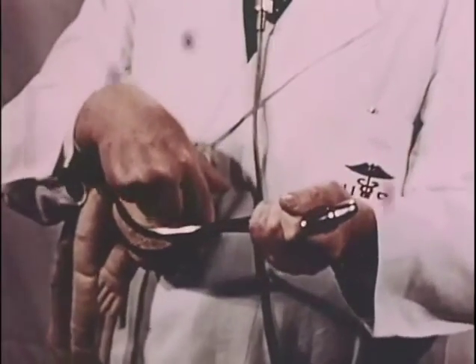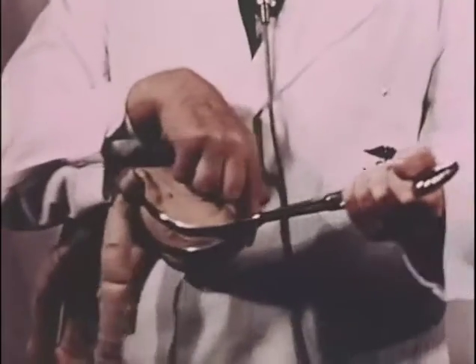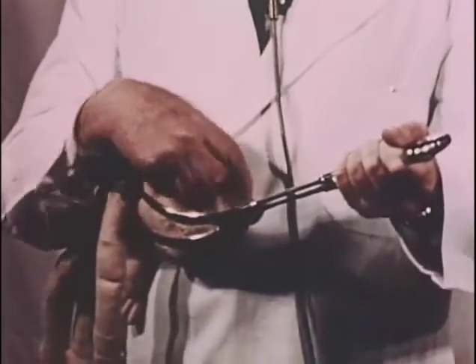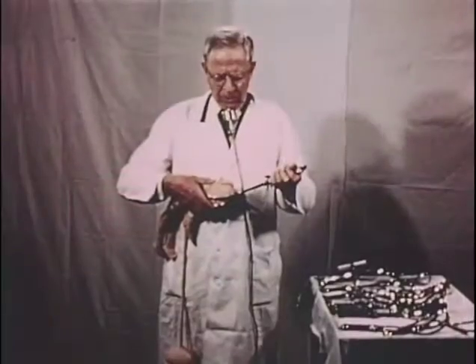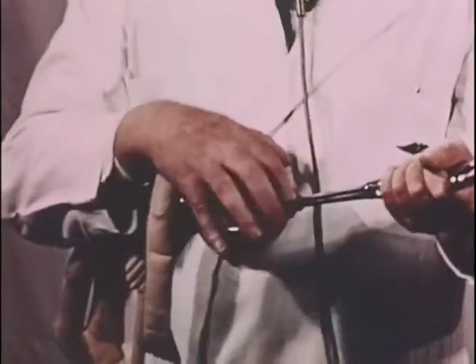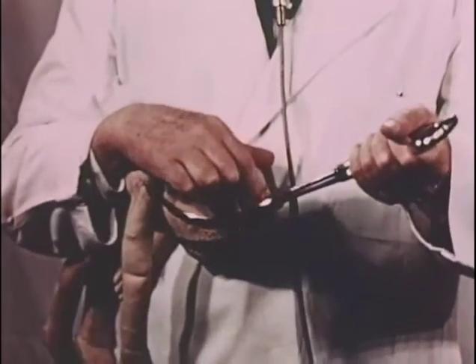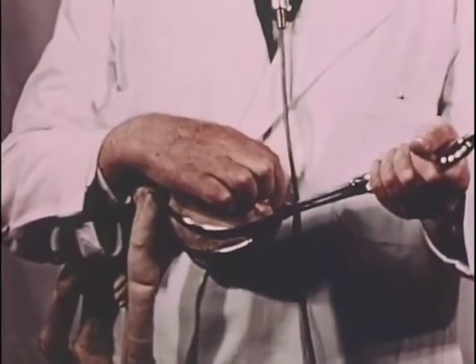If the sagittal suture curves off after it passes below the plane of the shanks, curves to one side or the other, that signifies the undesirable brow mastoid application, which gives unequal pressure on the tentorium. And finally, the lower angle of the fenestration can barely be felt, if at all, in advance of the head.